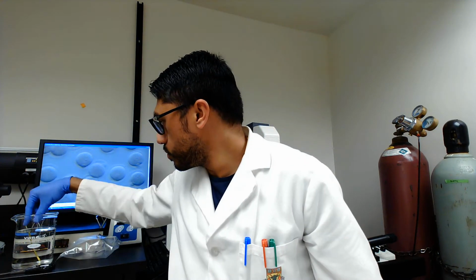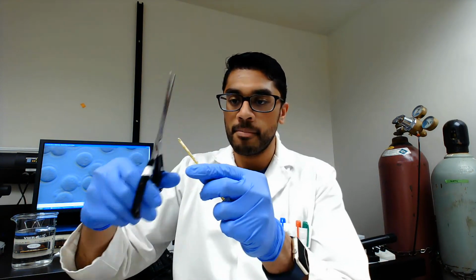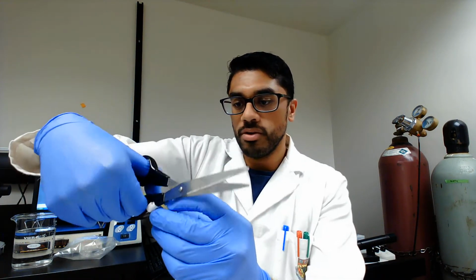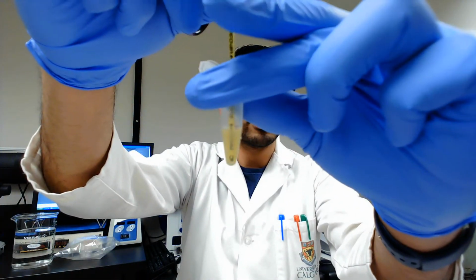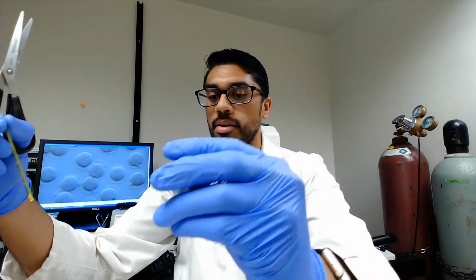Now, I'll just show you what we can do with the sperm here. We cut the top of this straw like this. We flip this over, and if we cut this side, it's kind of like a vacuum. It'll release the contents of that sperm into this Eppendorf tube. And this is the actual sperm that we use in the lab to fertilize our oocytes to generate something like a zygote.